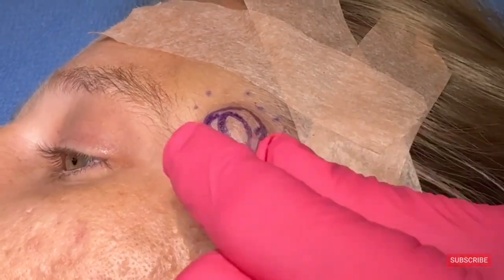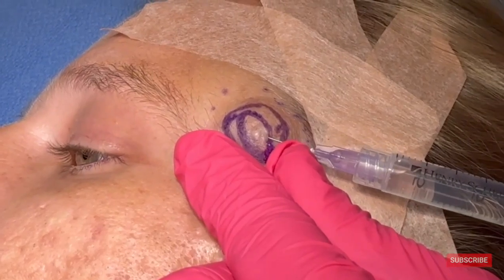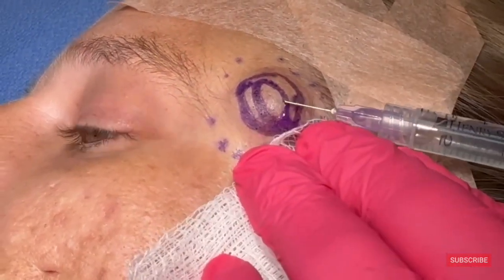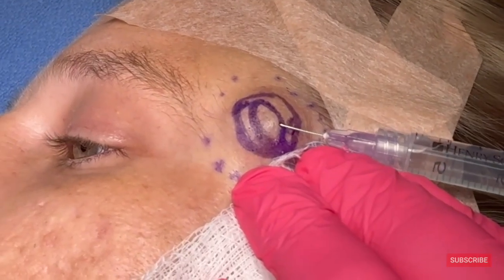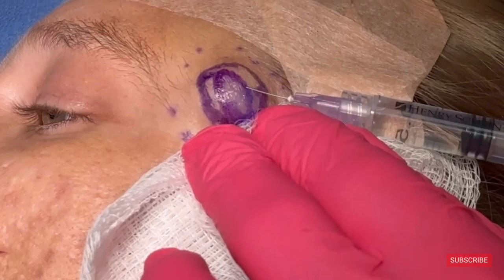And the reason we do this is not for pain, not for bleeding. It's for spreading the cyst away from the skin. As you can see, clearly it is dissecting. And really, this is the only way to numb these. And you want to dissect it.